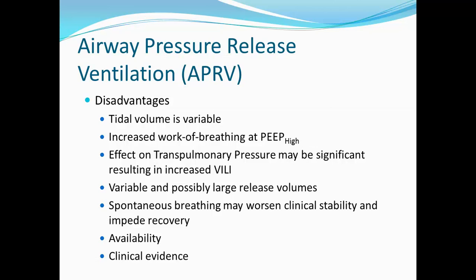As we know, they are variable, but they may be very large, and in fact the tidal volumes may be much larger than the 4 to 6 mils per kilo that the ARDS net protocol would like us to stay within. There's also some evidence to show that if we allow the patient to breathe spontaneously early on in ARDS, we may actually worsen the clinical stability and prolong ventilator days.